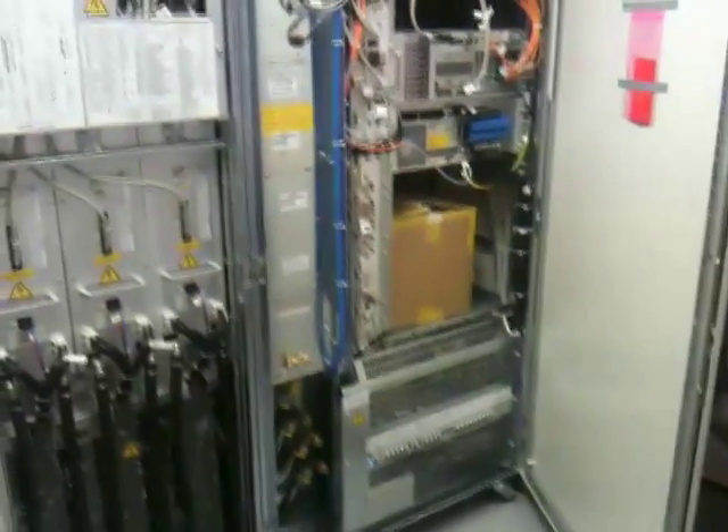Just an overview here — gradients to the left, control on the right, and there's a random cardboard box. Not sure what that's for.